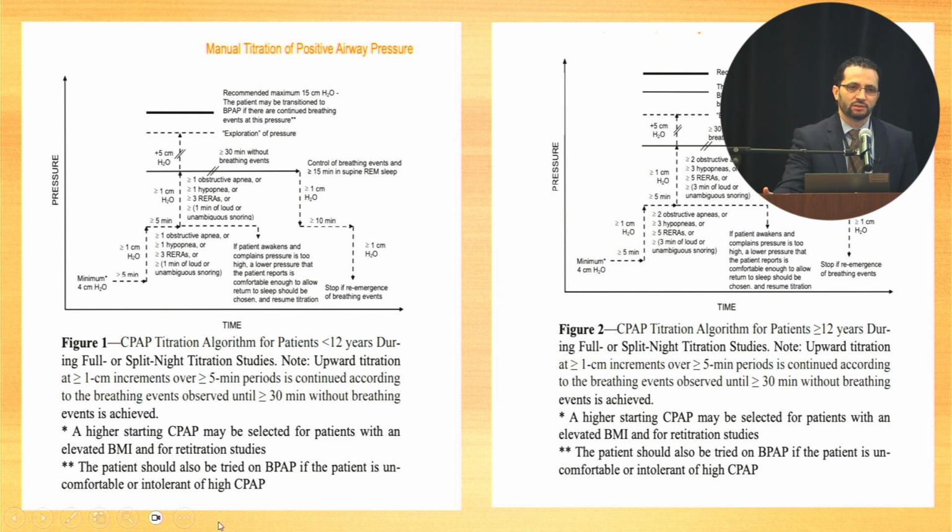You need to switch or increase your pressure support for the patient, or CPAP intensity, if you see a slightly higher number of events in adults. So you need 2 obstructive apneas, 3 hypopneas, or 5 respiratory arousals before you change your CPAP. So don't change CPAP too fast or too often, because it will cause a problem finding the best pressure when we read the sleep studies, because the AHI calculated will be really high given the time.